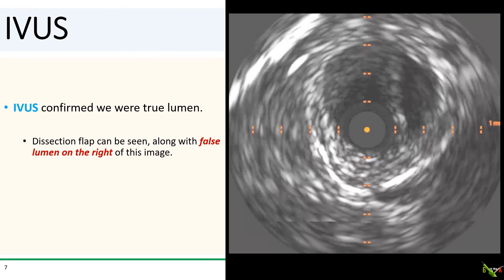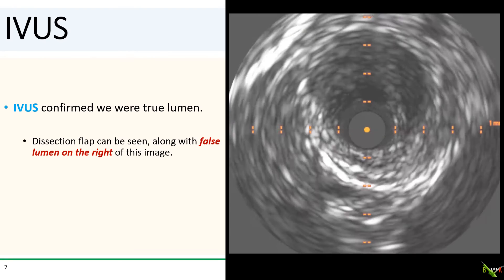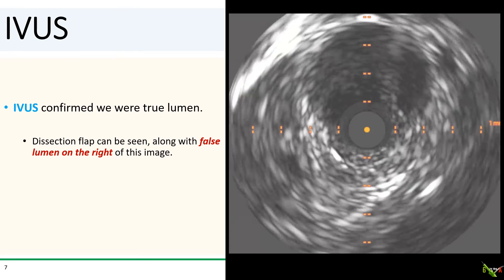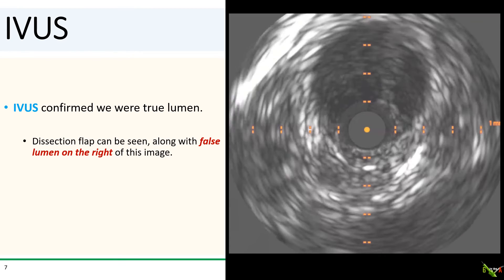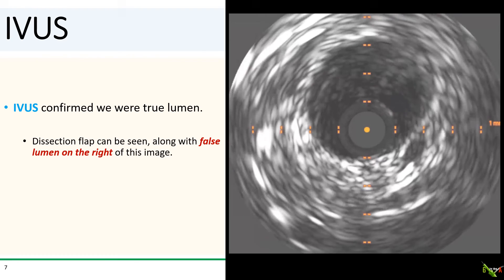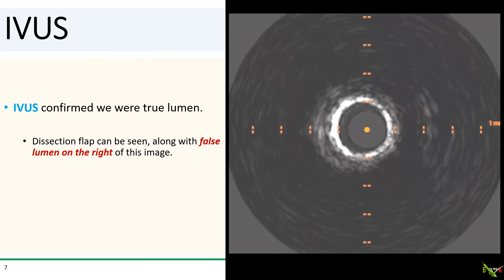Here is the IVUS run. Fortunately, it did look like we were in the true lumen. We can actually see the dissection flap, which is that vertical shadow you saw in the images, along with the false lumen on the right side of the image. So now all we had to do was stent the dissection flap and tack everything up.